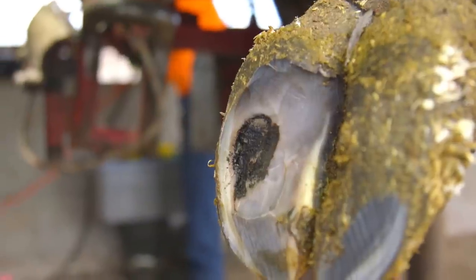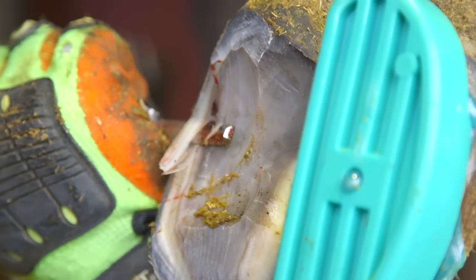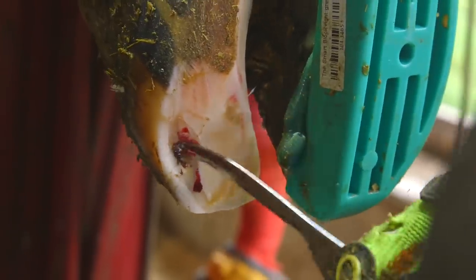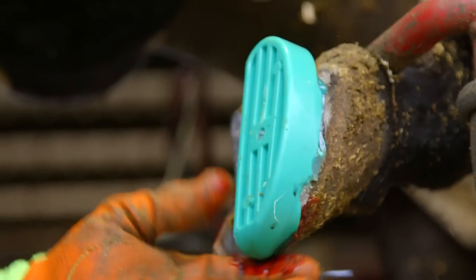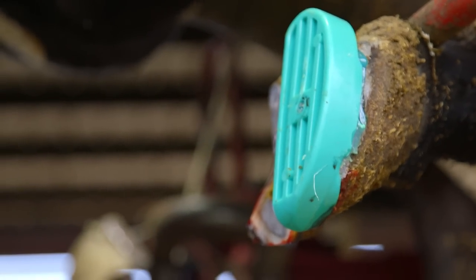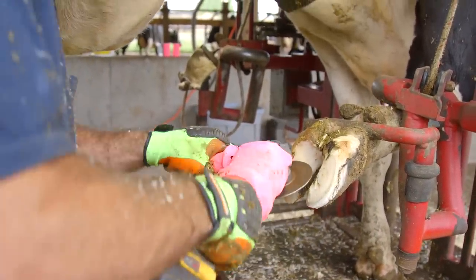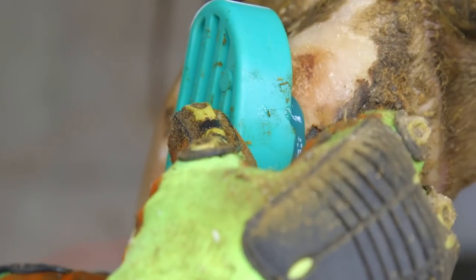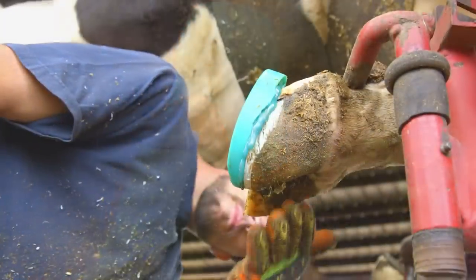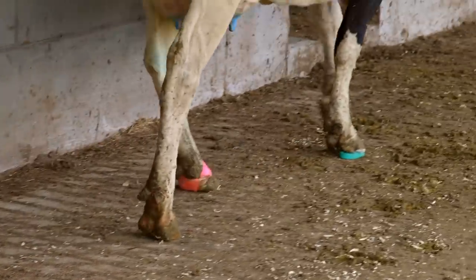Some lesions are obvious, while others require a more thorough investigation. In the case of a sole ulcer or white line abscess, therapeutic trimming to remove necrotic tissue followed by application of a block may be required. A block is applied to the healthy claw to increase height and relieve pressure on the affected claw to promote healing. A wheel grinder can be used to lightly rough up the claw surface to improve adhesion of the glue. Glue is applied to the surface of the block and then pressed into place on the sole of the healthy claw. Once the block has been properly applied, the grinder can be used to modify the block if necessary to improve functionality.